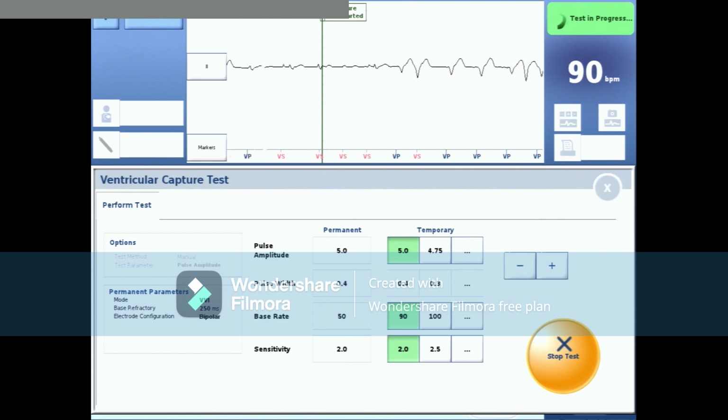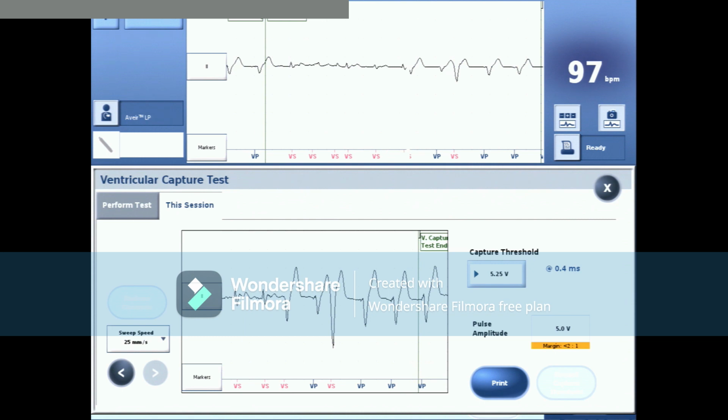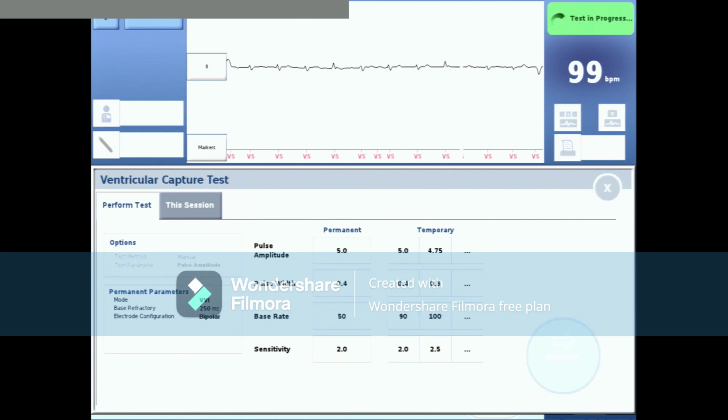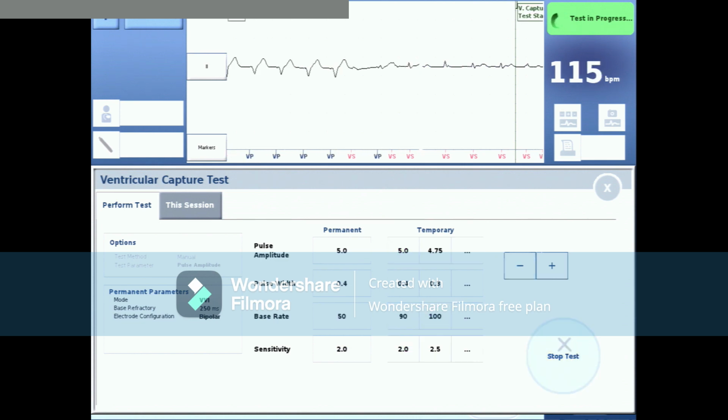Actually, after you deliver it, it's customary for the threshold to be significantly increased and then come down. So definitely you have to wait. I'm not sure, guys, if you went to the exhibition and visited Abbott and Medtronic. They have a simulator and a device. You can actually see it, and you can imagine the current of injury from the AVEIR device. So that's why I think it takes 24 hours for recovery.